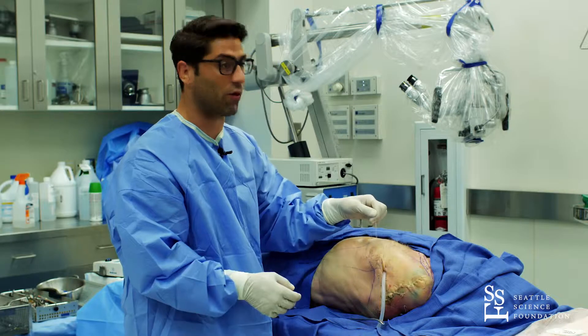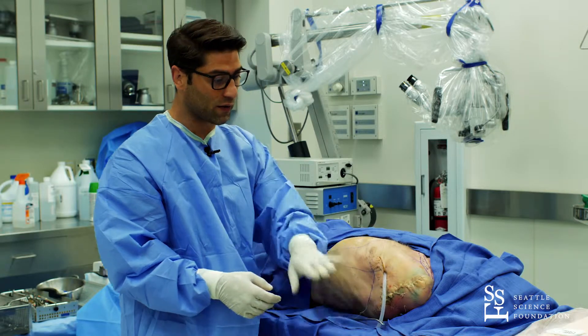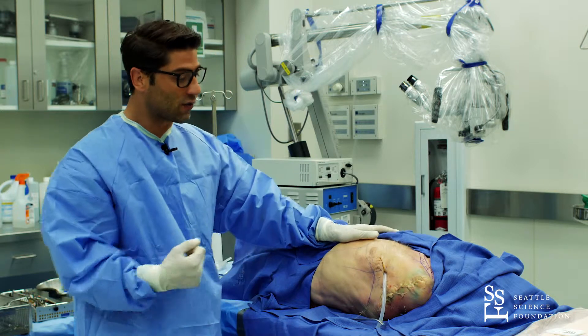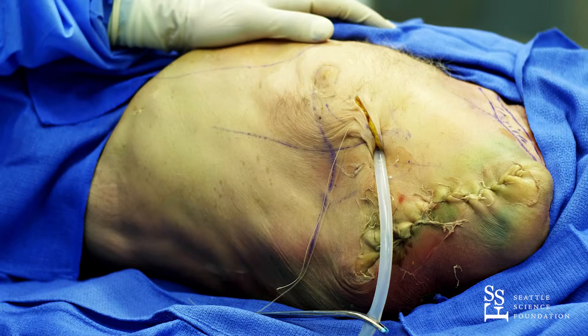After that — very importantly — use your device to suck out all the blood, and after that you definitely need an X-ray to make sure that the chest tube is in the correct position. That's it.